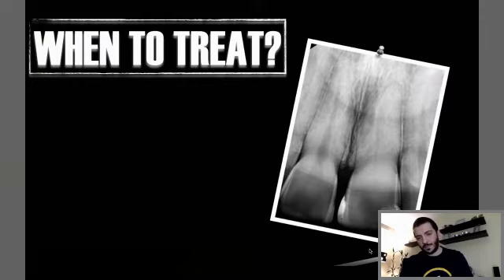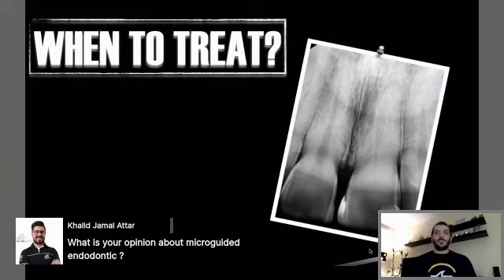Another question, I think this is really interesting, about the micro guided endodontic treatment. When do you suggest to use it? If for you it is useful or not? Yes, maybe it's useful for severely calcified teeth, but for me it's a little bit time consuming. It's a little bit of a difficult procedure to make the guide and start drilling.